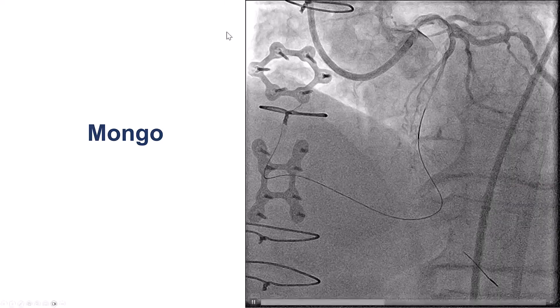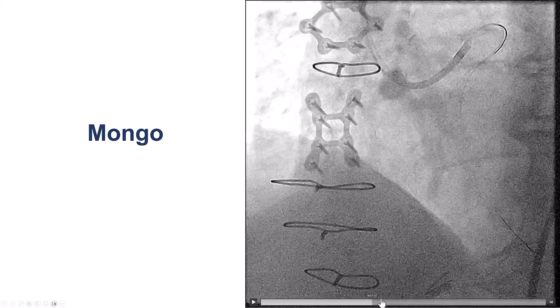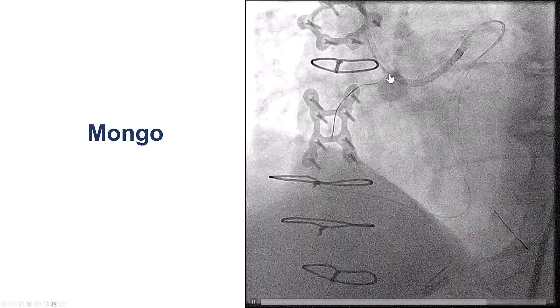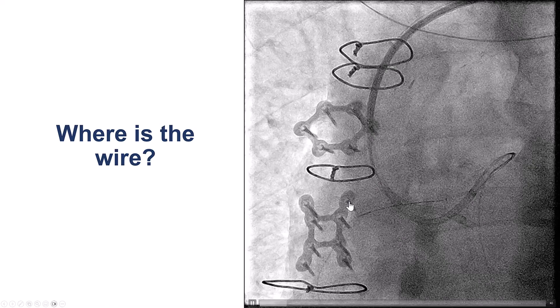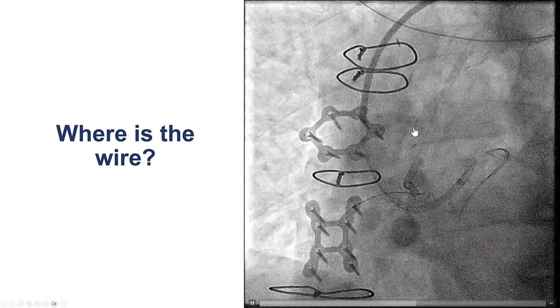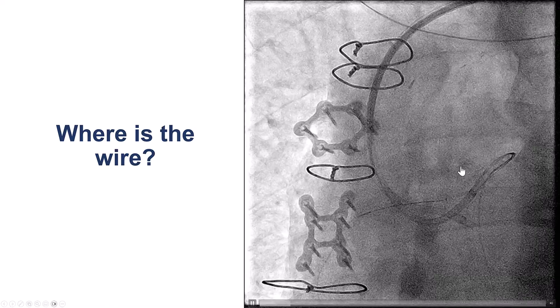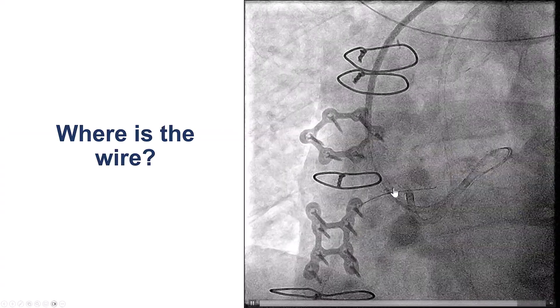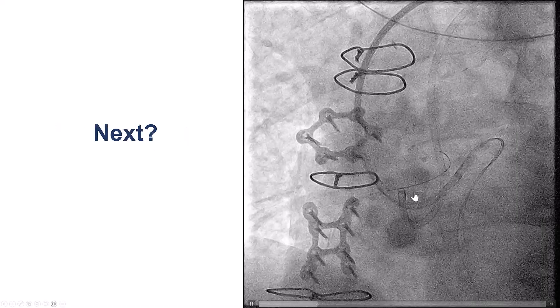We used the Gladius Mongo guidewire that went further up, and then we were able to deliver the Caravan all the way to the proximal right coronary artery. We then used the Gladius Mongo guidewire, which easily crossed into what seemed to be the aorta without much resistance in the proximal right coronary artery. However, the wire would not go up — it kept going horizontally. We took a guide from the right and made injections, and the guide touching the guidewire confirmed we were in the aorta. After confirming that, and partly by moving the wire with the guide, we were able to advance the retrograde wire into the aorta.